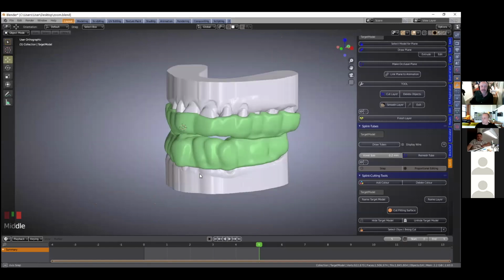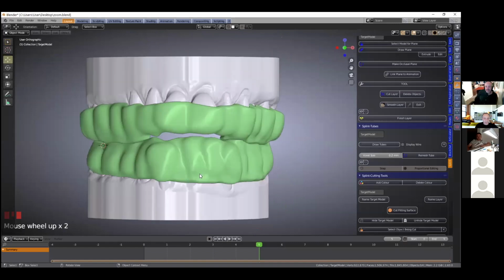Good stuff. So, of course, from here, you'd be able to do twin blocks and things. Have you got a video for twin block? I don't think we have one. Once the guide module is out, then maybe we can make a twin block. I think we didn't want to put a twin block out there because we may just get inundated with questions.